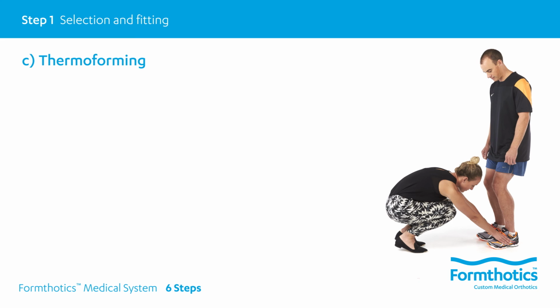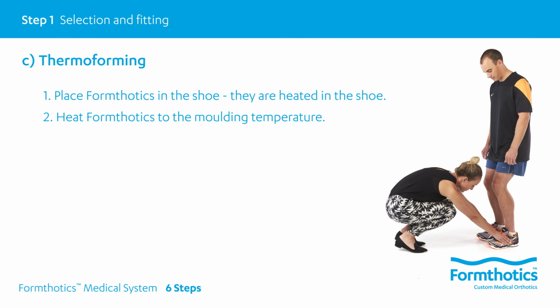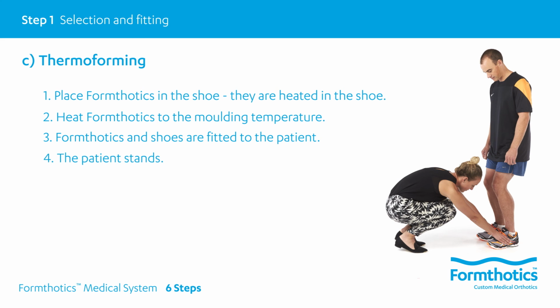Thermoforming involves Formthotics being heated inside the shoe so that Formthotics adapt to the internal shape of the shoe. Heat Formthotics to the molding temperature. At the correct temperature, they will feel different, more squishy. Once heated, fit the shoe with the Formthotics inside to the patient. If the shoe is a little loose-fitting around the ankle, the laces can be done up. Otherwise, this is not essential. Now, with wonderfully warm feet, ask the patient to stand.